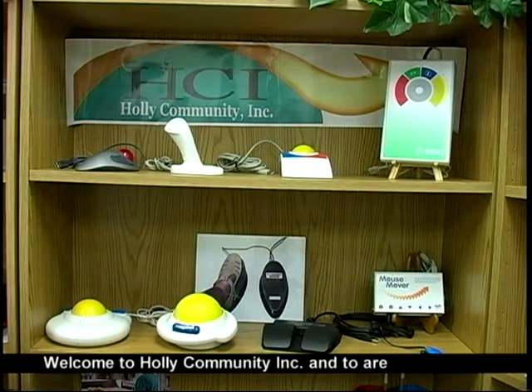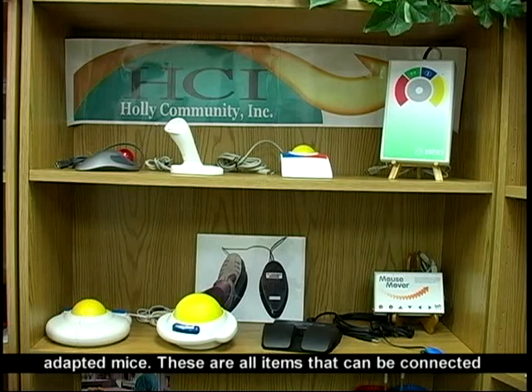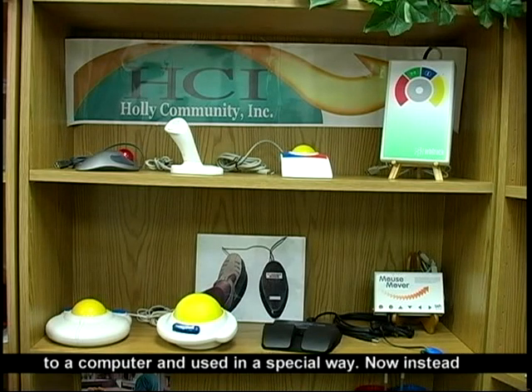Welcome to Holly Community Incorporated and to our demonstration center. Today I've put out some of our adapted mice. These are all items that can be connected to a computer and used in a special way.